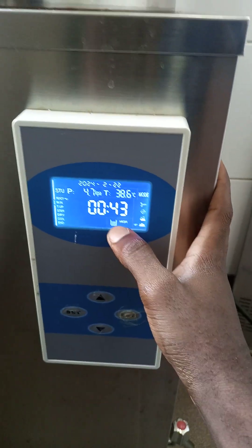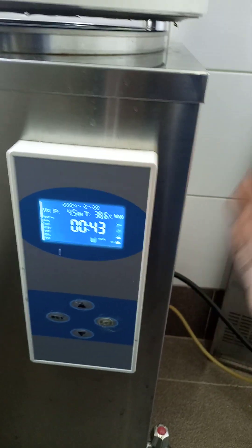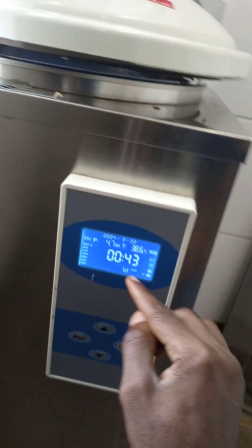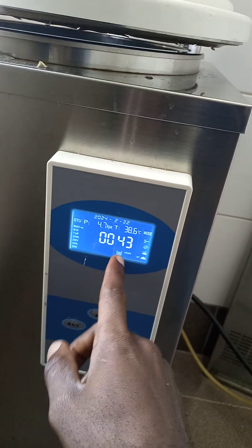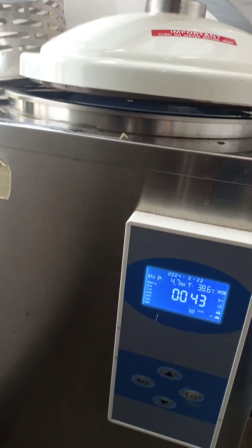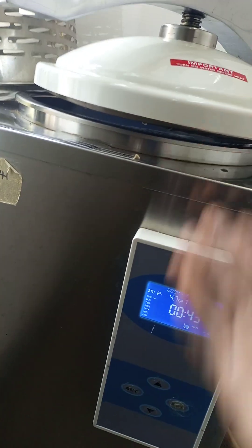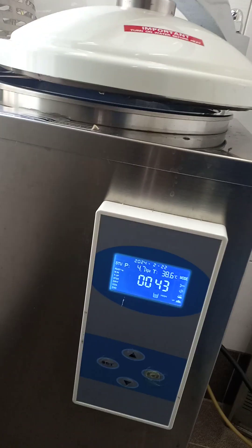But now another problem it's having is with the water level display. On the faulty autoclave, you'll put the right water level inside but it will keep showing that the water level is not right, even though you're sure it's the correct amount of water. Actually, even if you fill it completely up it will still show the water level as not right.